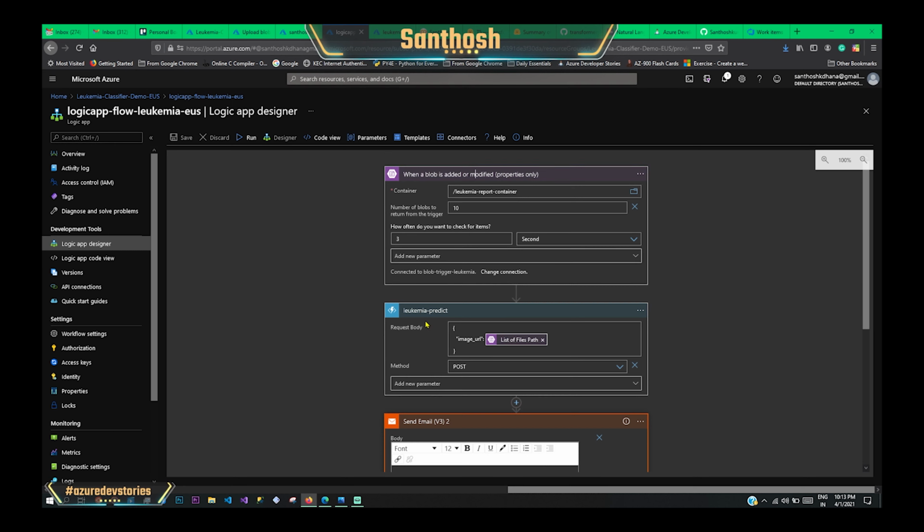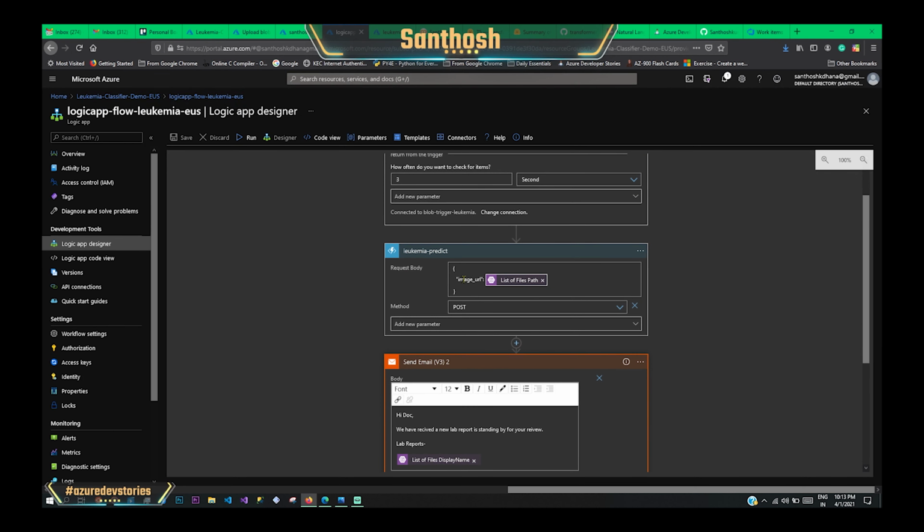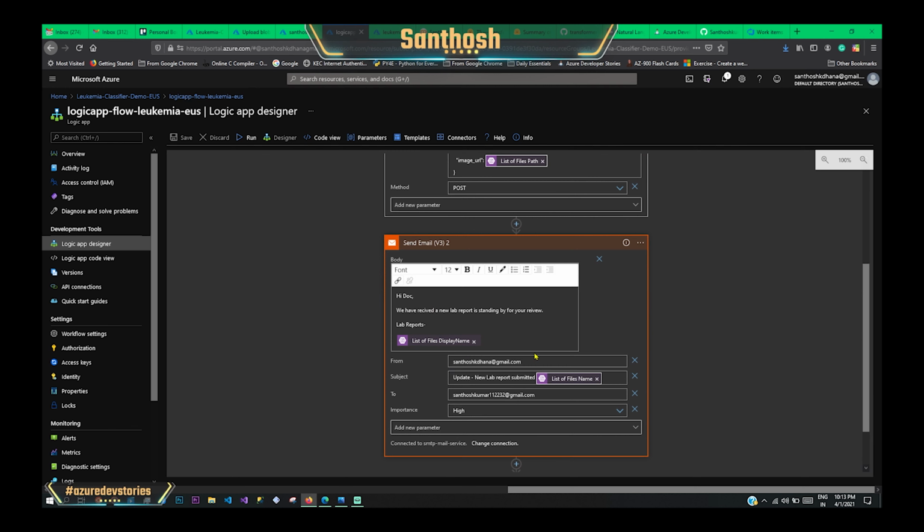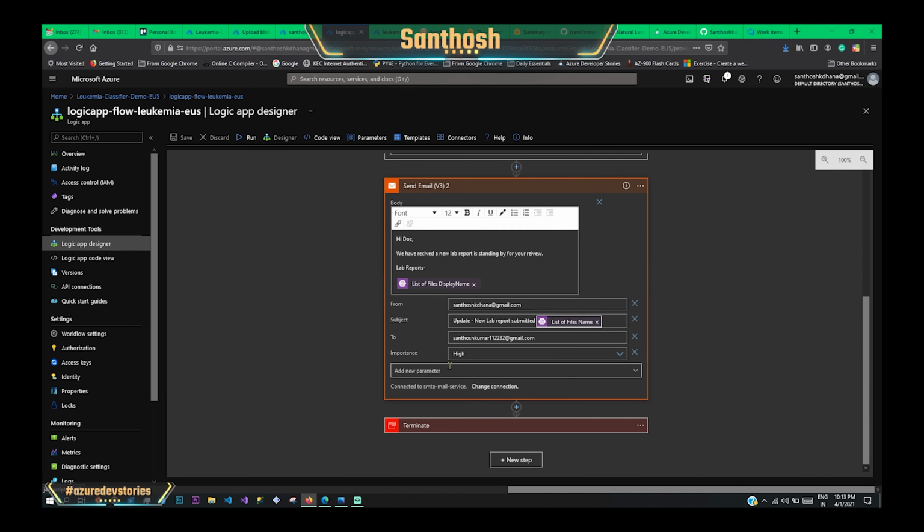This is triggered and then it passes the file path to the function that we have. We have the image URL and the post request, and once this is done, it also updates the Cosmos DB with the prediction. There is an email trigger that is sent across to this email ID stating that this has been received, and so on, and we terminate.